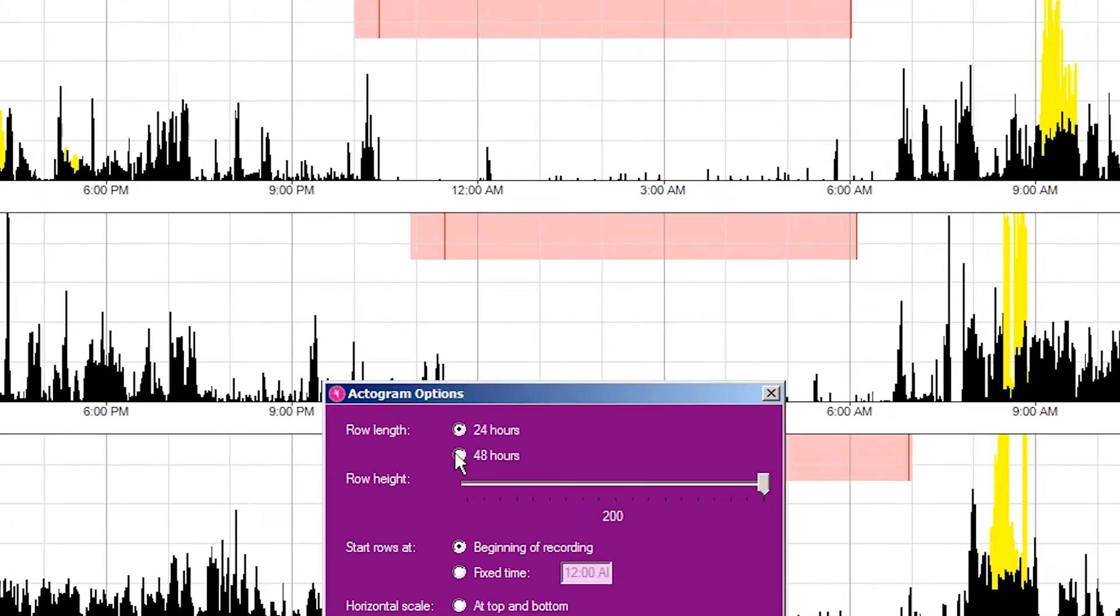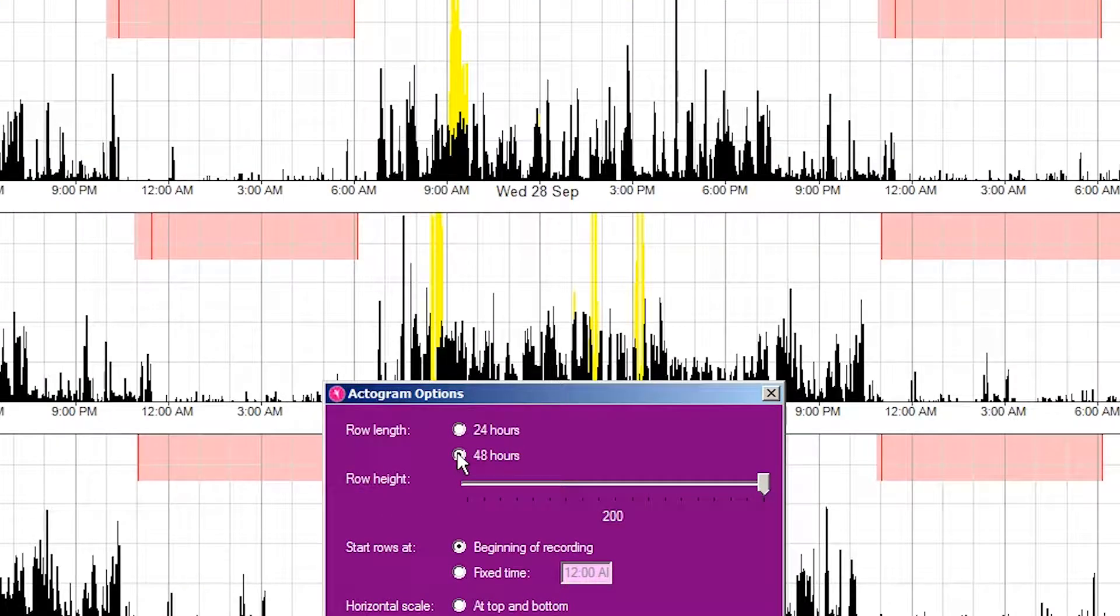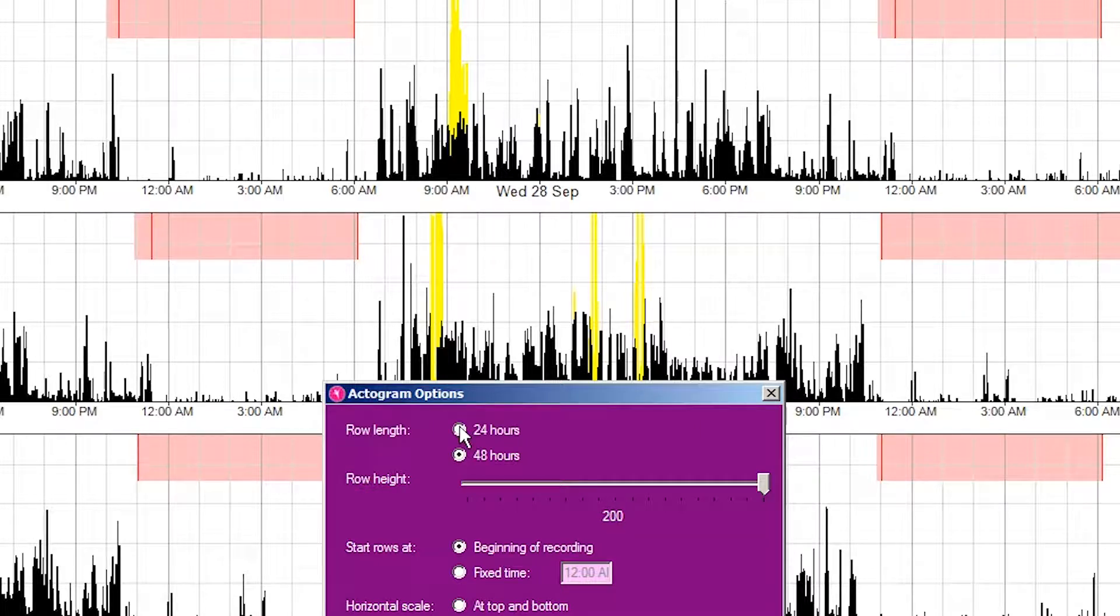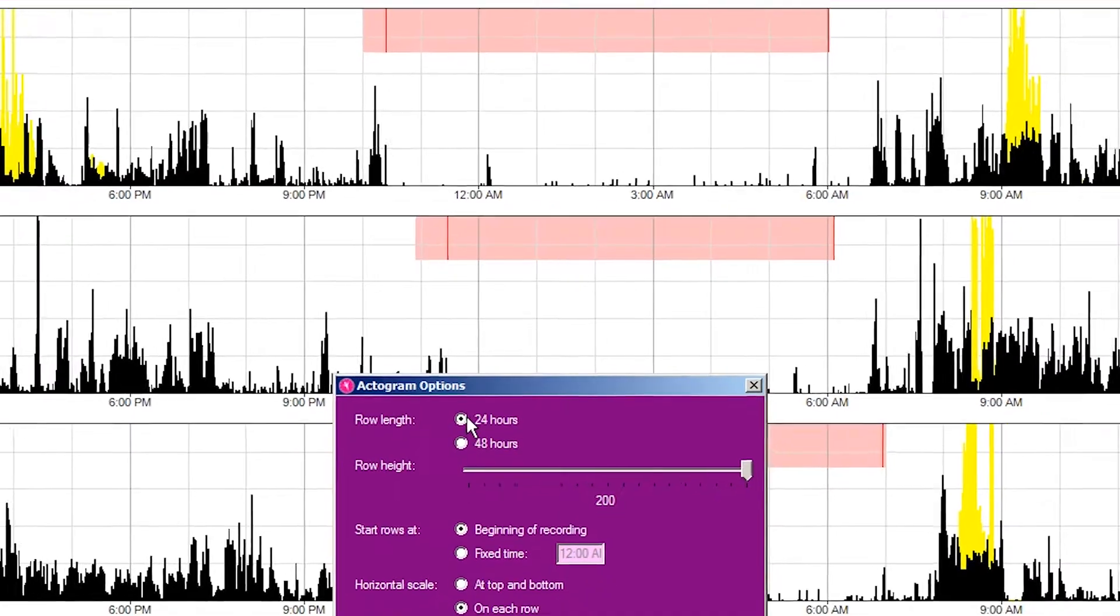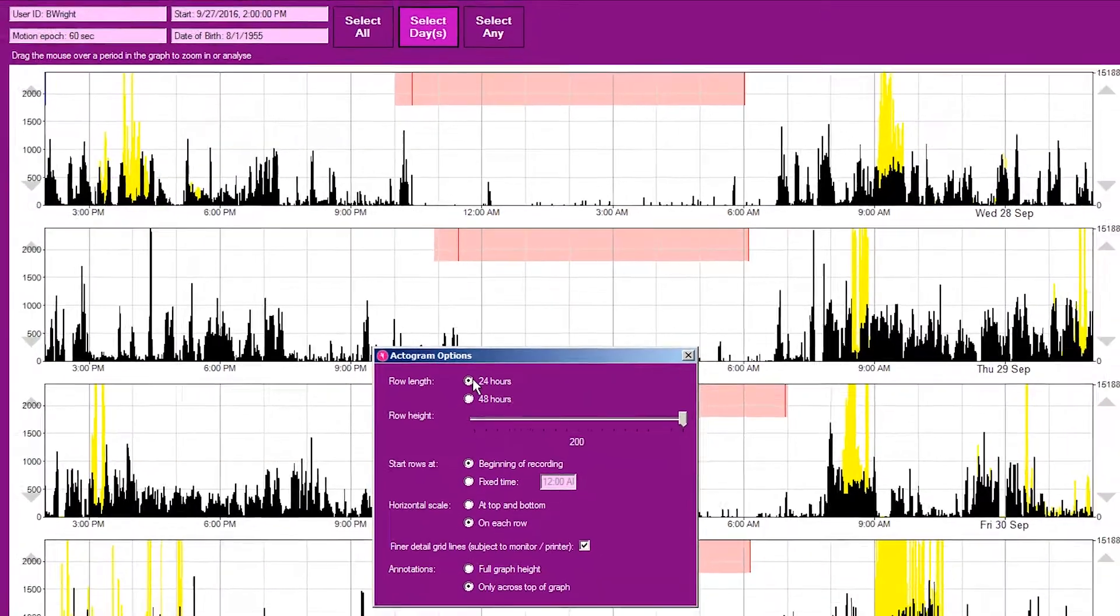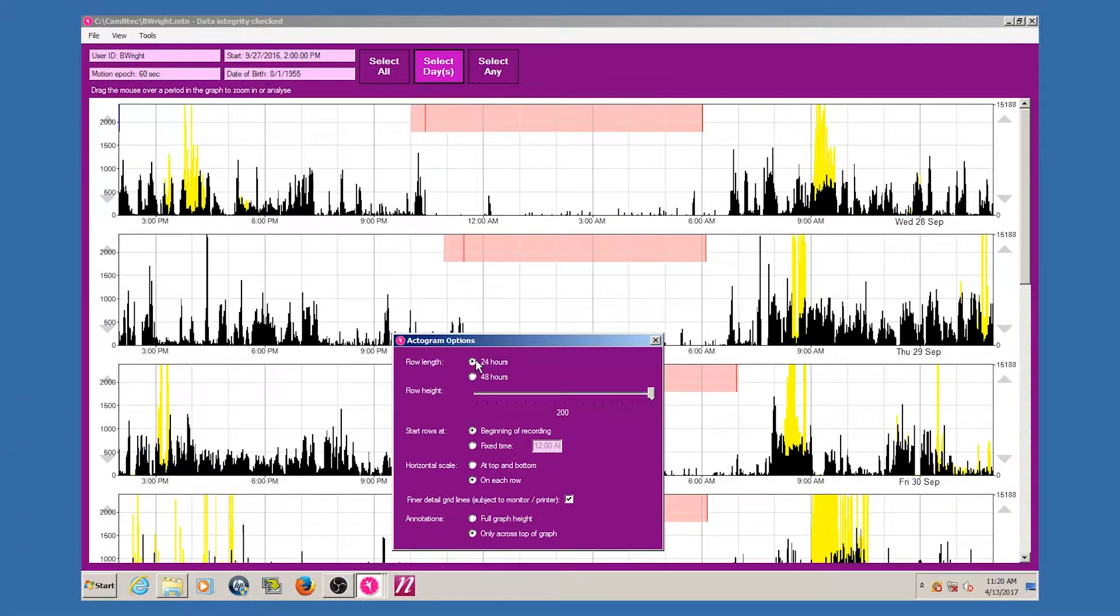24 or 48 hour graphs are available to show single day or double day plotted graphs respectively. Most users will choose the 24 hour graph. Each row of the graphs will then correspond to the length chosen, but the change forwards between rows will be 24 hours in both cases.